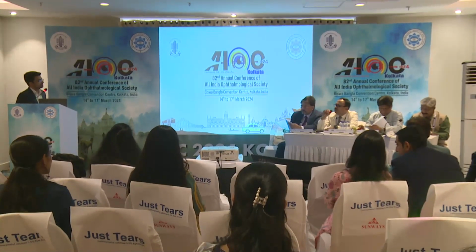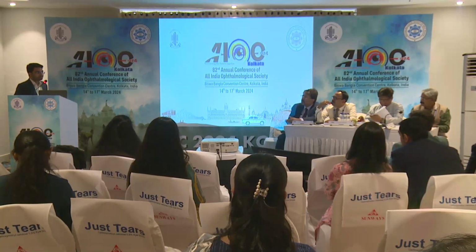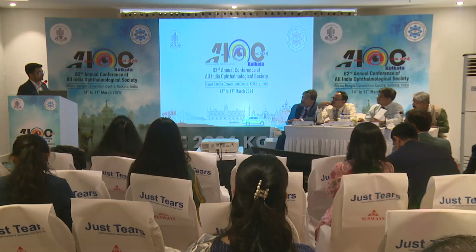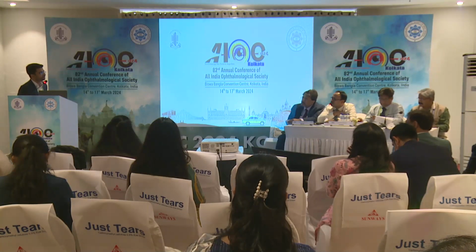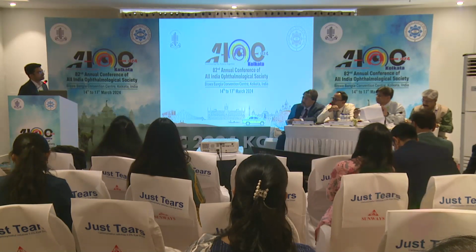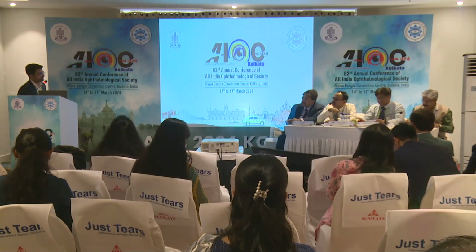So one thing, why did you laser that retina? There were some suspicious lesions which the retina fellow could see where the haptic was just impinging on the retina. So she thought it's better to laser rather than leaving it. But you did some scattered laser instead of barrage. Yes, sir. It was lying down over there. It was hanging and touching in that area. There, she felt that there was some discoloration and not a healthy retina.